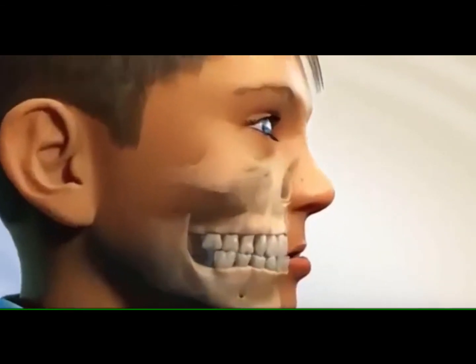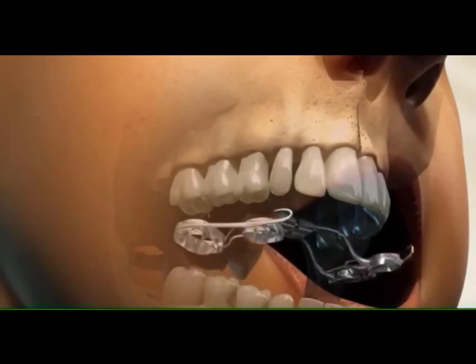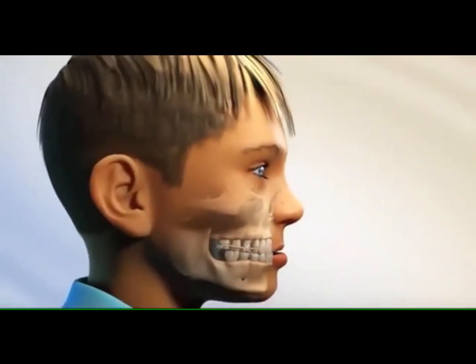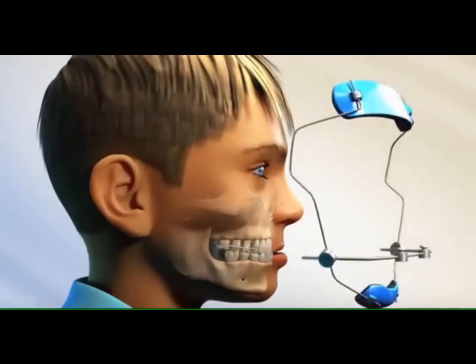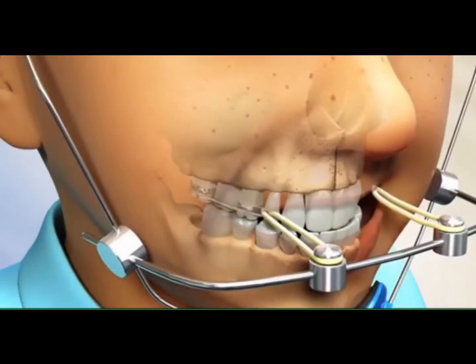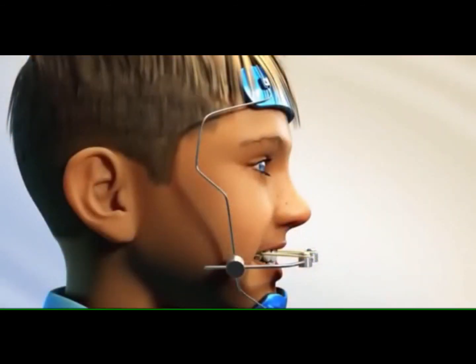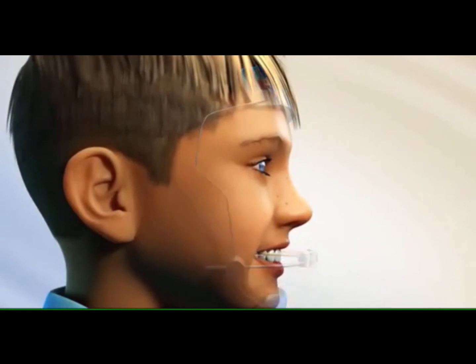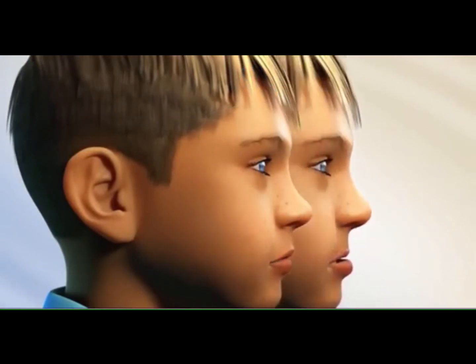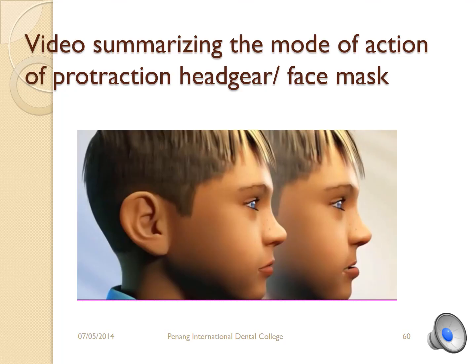This video shows the summary of the mode of action of the reverse pull headgear. We can see that the patient initially presented with restrained growth of the maxilla, and we put the intraoral appliance, and then we put the face mask. Elastic is attached to the intraoral appliance so that we can have the force to move the maxilla forward. Then finally we will get the positive overjet back.